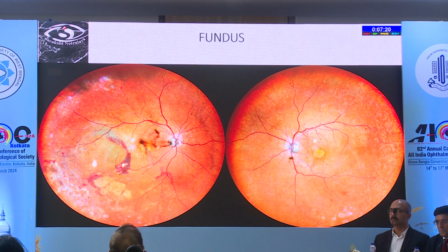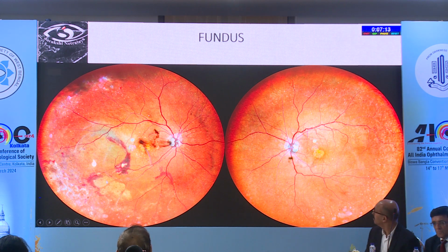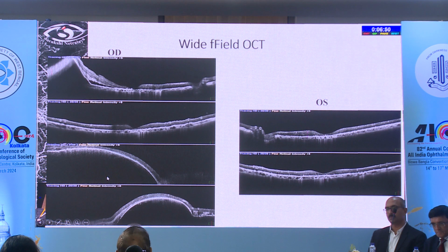This is the mother of a pathologist who has a peripheral PCV. On a color widefield photograph you can see a large peripheral mound. On a widefield OCT you can see the macula and also the scan which goes through the peripheral lesion, and you can see the fluid creeping into the foveal area. This OCT goes through the PCV lesion where you can study the image well.